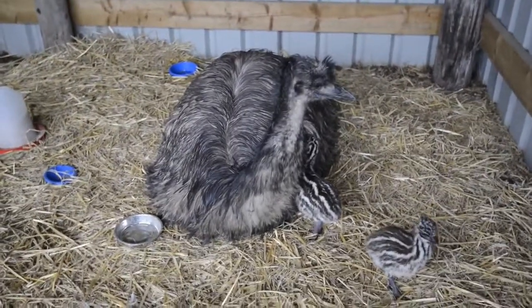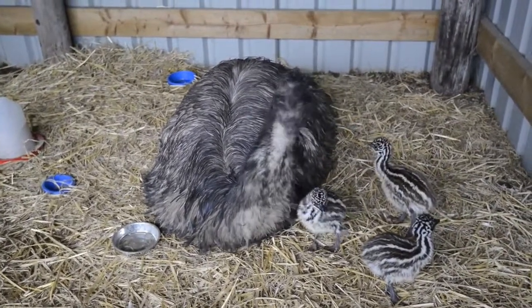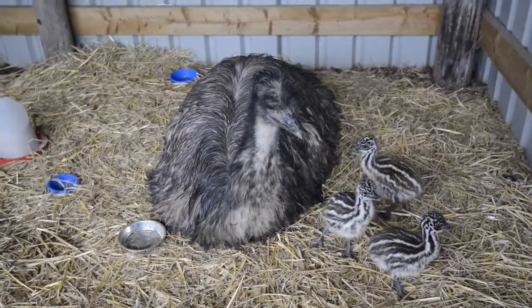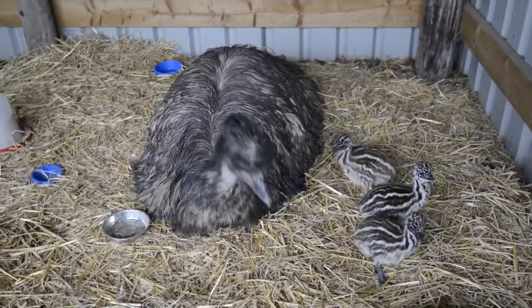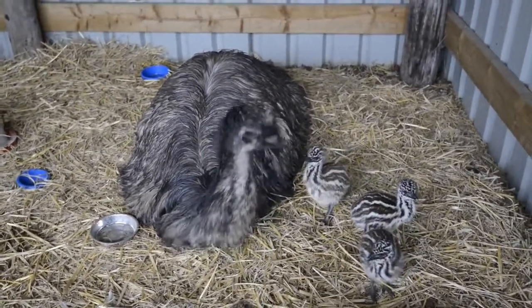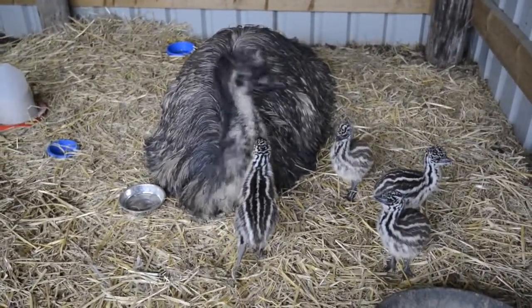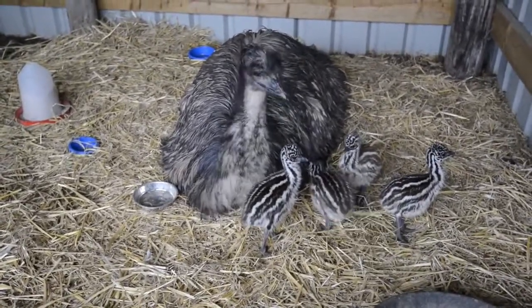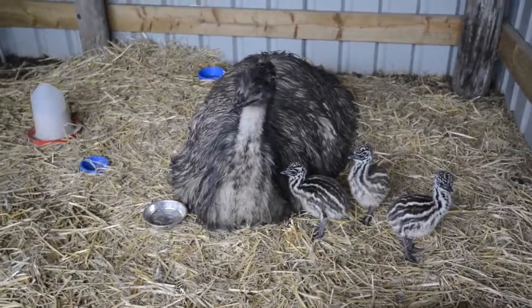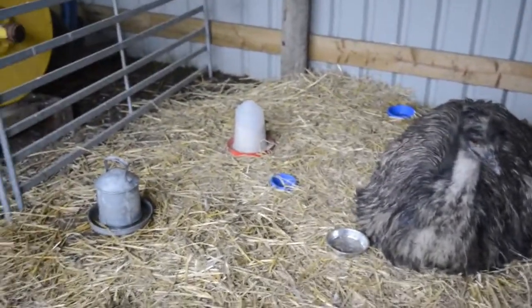Here we are on location at Park Farm Emus. It's just a short video to show the procedure for implanting a microchip into a newly hatched emu chick. The chicks you see running around there were microchipped a few days ago. They're all quite happy, and we're just going to show you the implantation of a microchip into a day old chick.